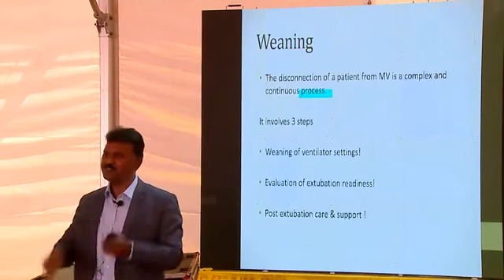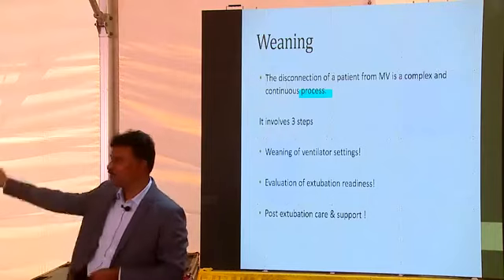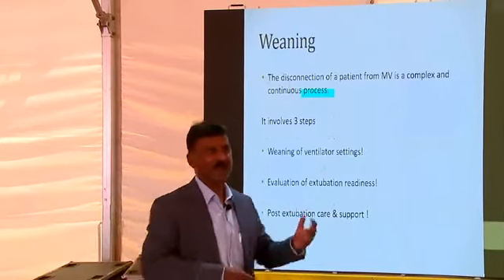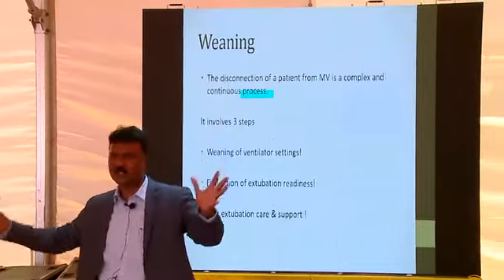Or if you go and do something, the nurses also say, doctor, you come and keep touching something, he was maintaining, and you people have done this. So it's a problem, understand us. Yes, you can't afford to just come back in the morning and wean; weaning is a 24-hour process.